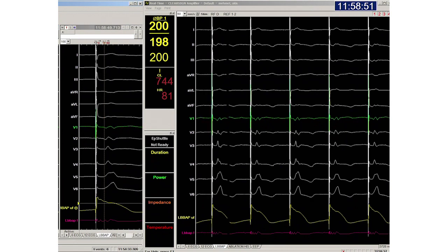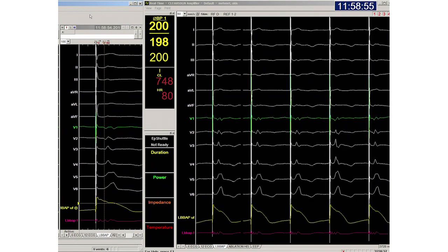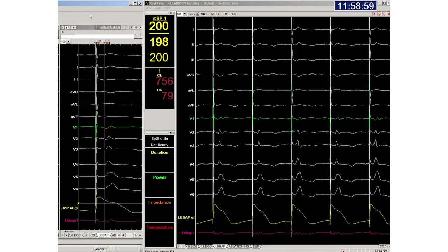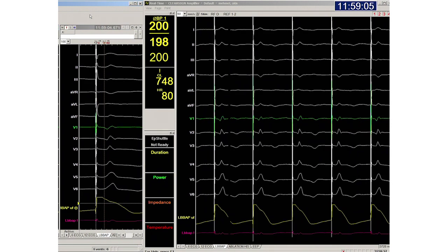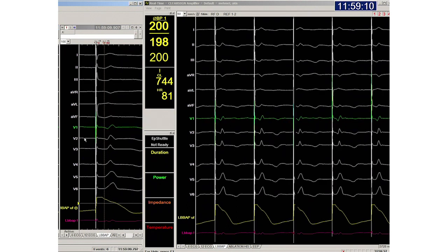We can see the R wave in V5 becomes monophasic with a fast upslope. This is a patient with advanced conduction disease, as there is a long interval between the pacing stimulus and the onset of the QRS wave. But with the QRS narrowing from around 200 ms to under 120 ms, the final result is very satisfactory.